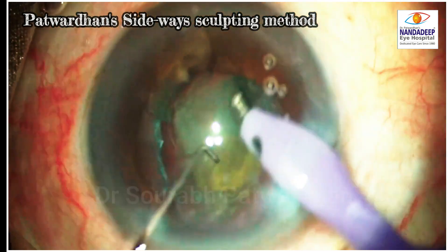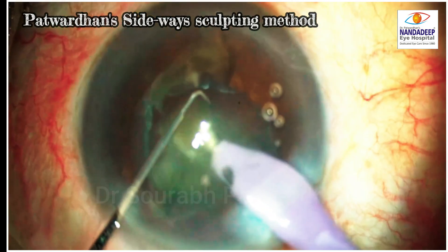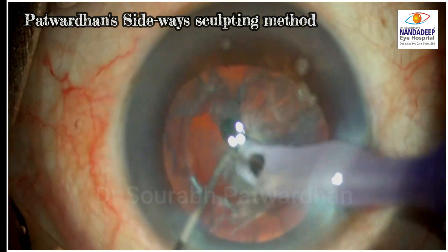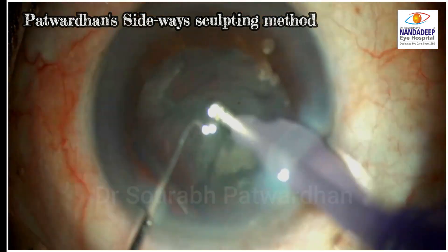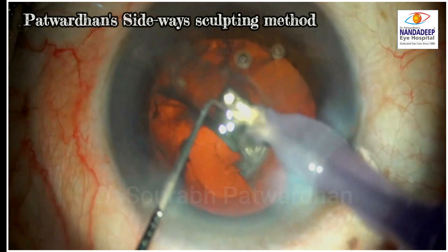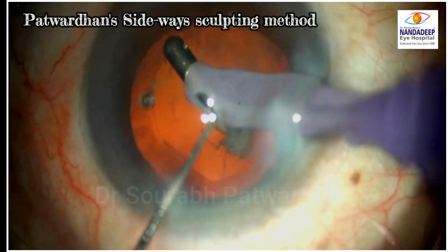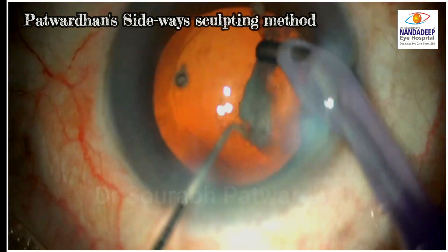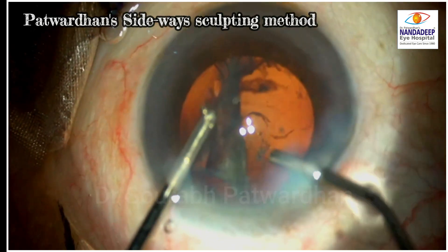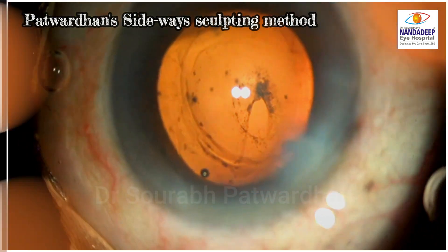All four quadrants are emulsified avoiding nucleus rotation, preventing excessive stretch of the posterior capsule. Thus even a weak or defective posterior capsule will not open until all nucleus is removed — which is critical, because managing a dehiscence after nucleus removal is far easier than when it occurs with nucleus still inside. Cortex aspiration was done 360 degrees by floor petal method, removing from all sides and the central plaque last. After cortex removal, we found a pre-existing opening in the posterior capsule — confirming that without these precautions and sideways sculpting, hydrodissection or nucleus rotation would have caused rupture and nucleus drop.